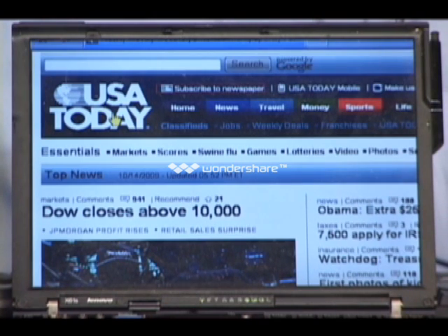Now, the thing that I wanted to show you on the internet is this. Low vision people have certain situations where things are difficult, especially on busy screens like the internet. Hunting down a link, where is it? Even if it's large, and especially if it's large and you're hunting around trying to find it, you have to click around and look for it and drag your mouse around to find that thing. Back when JAWS first was introduced and when we first started really using the internet, JAWS came up with a feature called the link list.